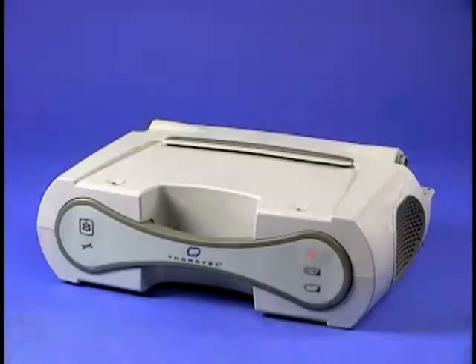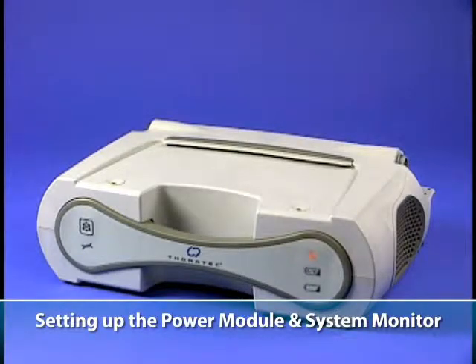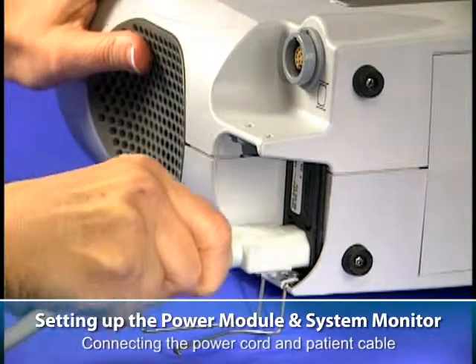These steps will include setting up the power module and system monitor, connecting the power cord and patient cable.